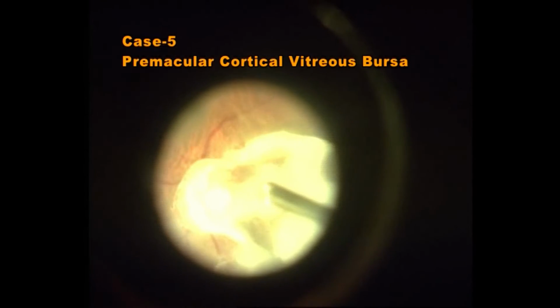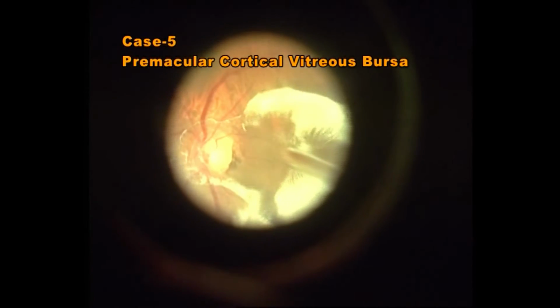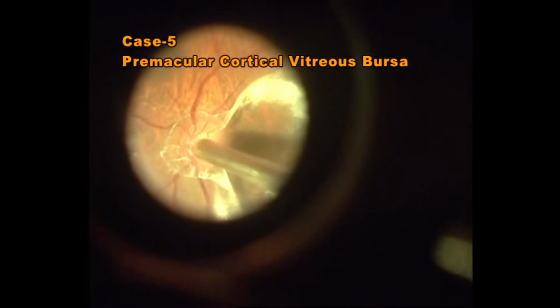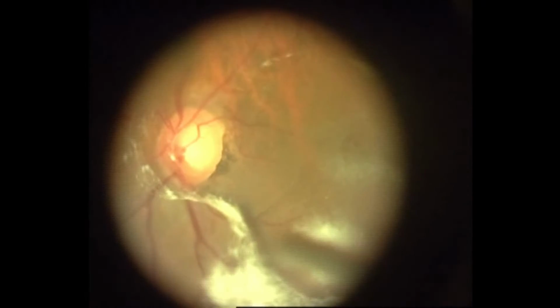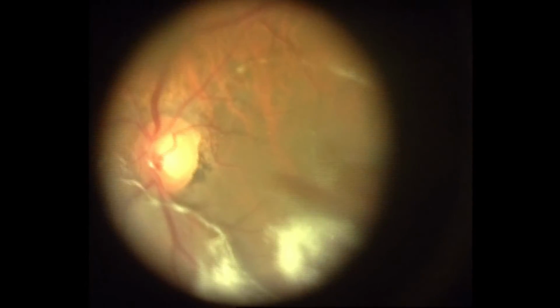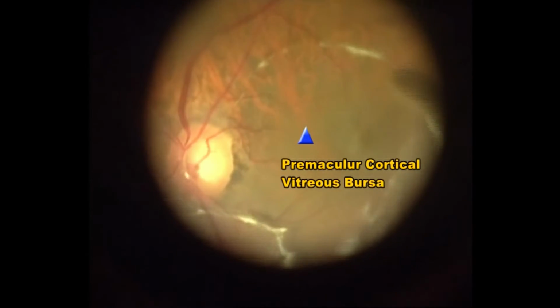This patient is a 72-year-old chronic diabetic with a posterior hyaloid face attached to the disc margin and also in a circular fashion to the parafoveal area within the temporal arcade. The posterior hyaloid face has separated over the macula within this area of attachment, forming a premacular bursa. The posterior hyaloid membrane over the macular area is taut and could not be torn with the active suction of the 23 gauge cutter.